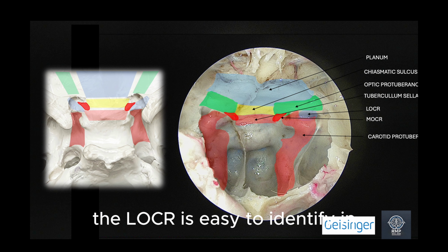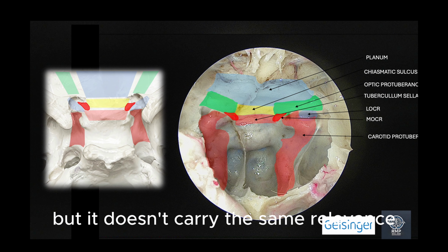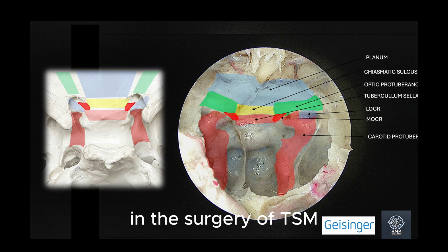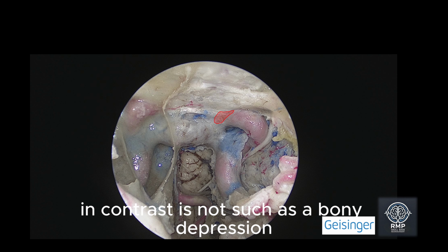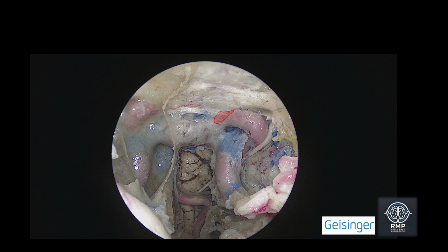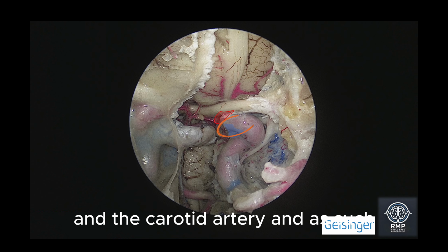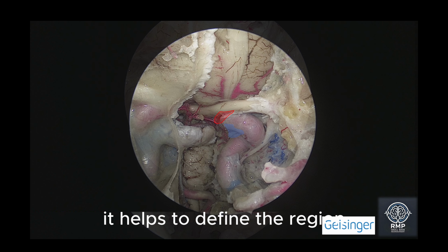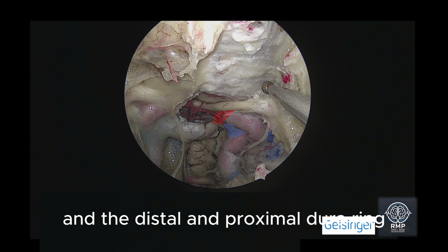The lateral opticocarotid recess is easy to identify in a well-pneumatized sinus, but it doesn't carry the same relevance in the surgery of tuberculum sellae meningiomas. The medial opticocarotid recess, in contrast, is not as much a bony depression, but it marks the transition between the medial aspect of the optic canal and the carotid artery. And as such, it helps to define the region of the paraclinoid carotid and the distal and proximal dural ring.